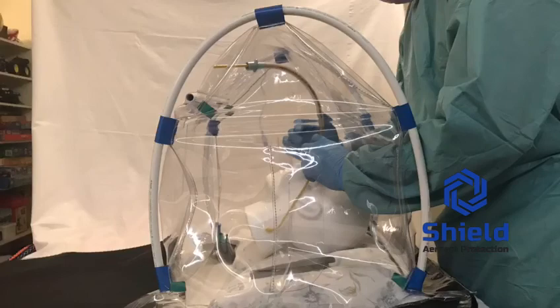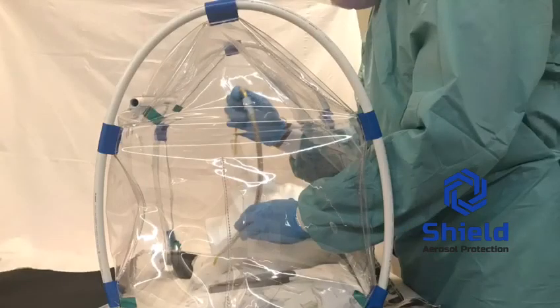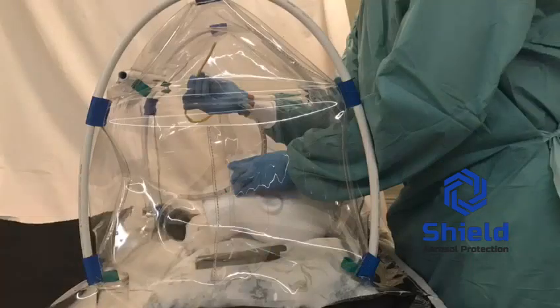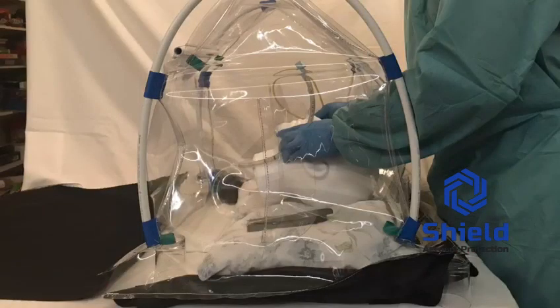Altogether, the 5 flaps in the tent allow for adequate ODP assistance, and that ODP must be wearing an adequate amount of upper body PPE, even though the tent is in place, to ensure that the forearms and the chest is protected during the opening of the flaps.